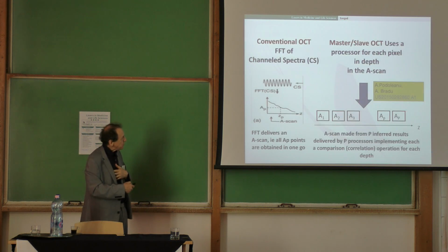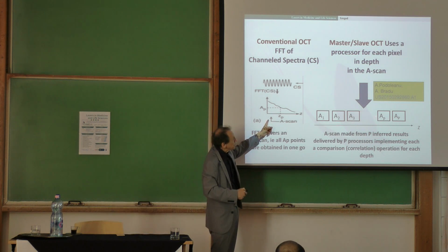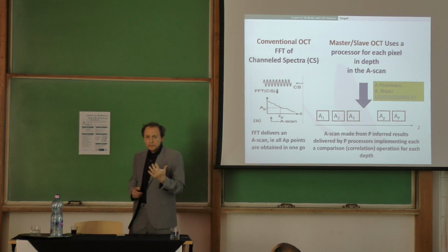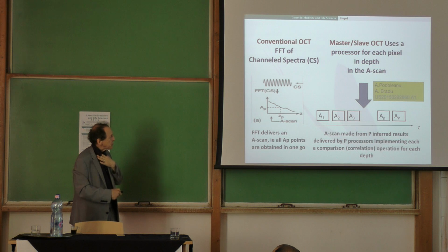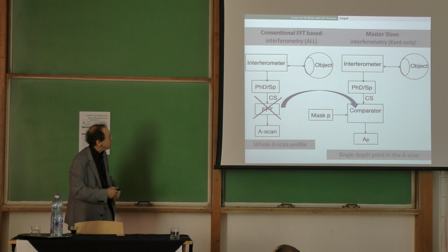In our technology, we have a processor for each depth. For each depth there is a processor. We produce that now in real time. Instead of doing an FFT, we have a processor. And that has several advantages, and that's explained here.